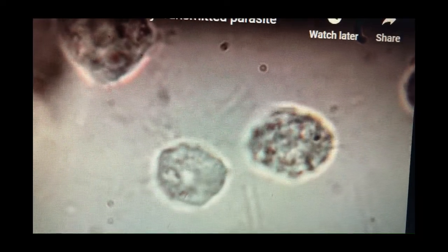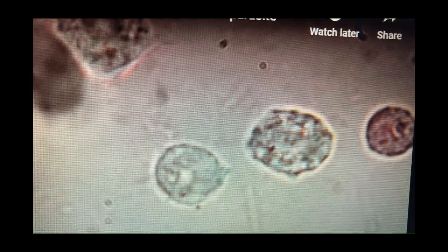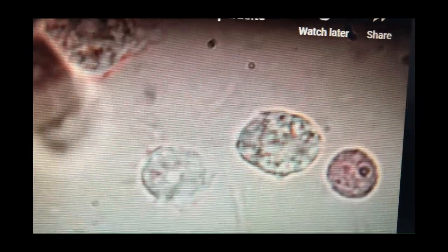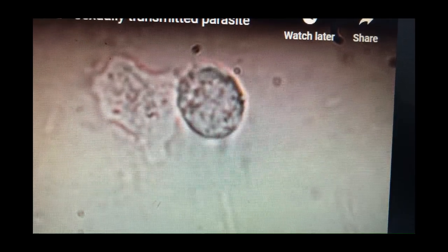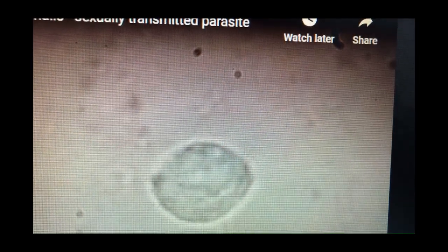This is what trichomonad is going to look like. They're pretty rare and you may not ever see them. But if you do it's going to look something like this. You'll see kind of a whipping action of a flagella at one or more ends of the organism and it has kind of an erratic movement to it.